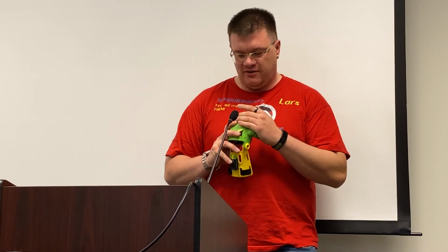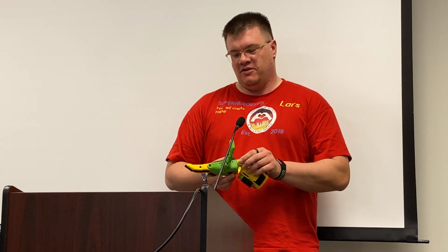So with that being said, the first thing I did was I took a look at the Phoenix hand. The Phoenix hand is nice, and it's actually the product that all of the kids in Germany like. Some like the Raptor hand, but this is the one that they like. And then I saw the videos and saw that most of the guys do it by hand. So they thermoform it by hand.